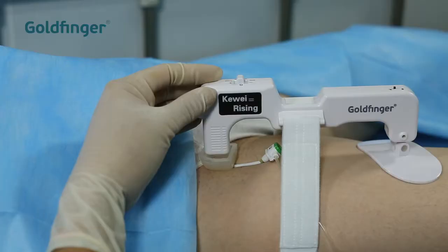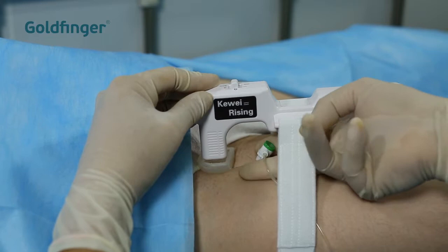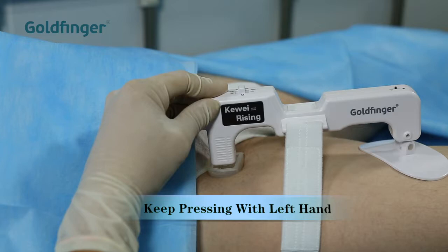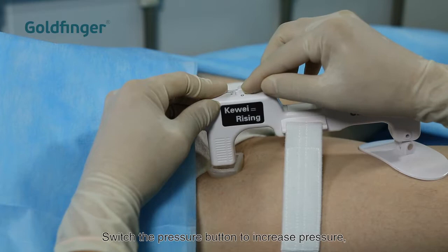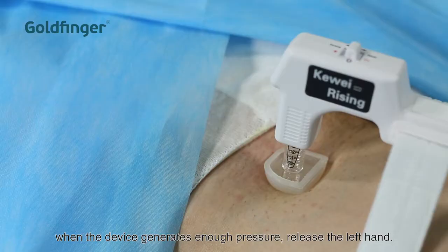When removing the sheath, press down the superior end of the unit with your left hand to prevent bleeding. Pull out the sheath with the right hand. Keep pressing down with your left hand. Switch the pressure button to increase pressure. When the device generates enough pressure, release the left hand.